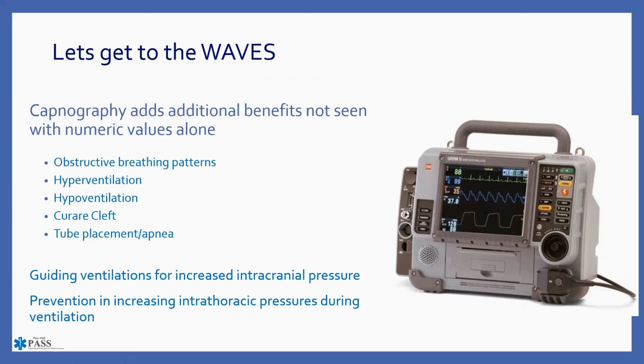All right, so let's get to the waves. Let's look at some of the waveforms that we're going to be talking about and what those mean. So capnography adds additional benefits not seen with numeric values alone. If you think back on that far left picture, when we were looking at capnometry, meaning just the numbers, there's not a lot of great information there. We know that number was 38 if my memory serves me correctly, but we don't know exactly what that waveform is looking like. Are they having an obstructive pattern? Is their exhalation too long? There's a lot of information that we're not able to get because we don't have the wave to look at.